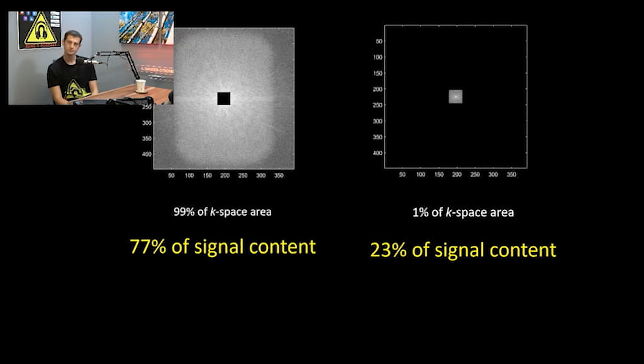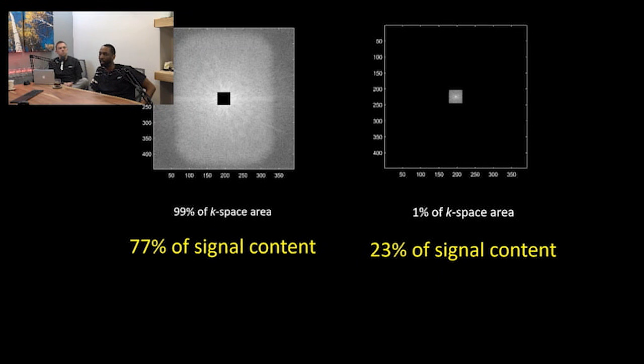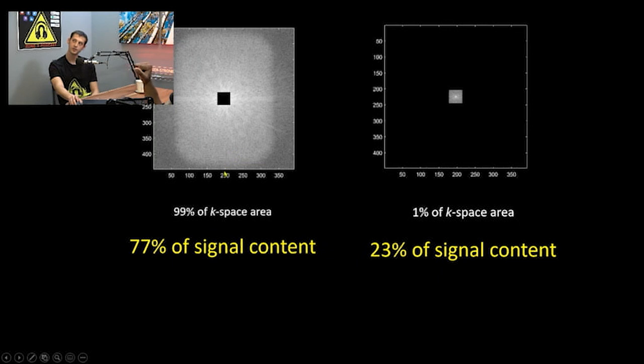And I know we touched on unwrapping. Whenever you're unwrapping an image, say on your cursor we're at 150, when you unwrap it, are you unwrapping to negative 150? Is that the same as 150 and 150? I should have done this plot as if this goes to 400 over here.